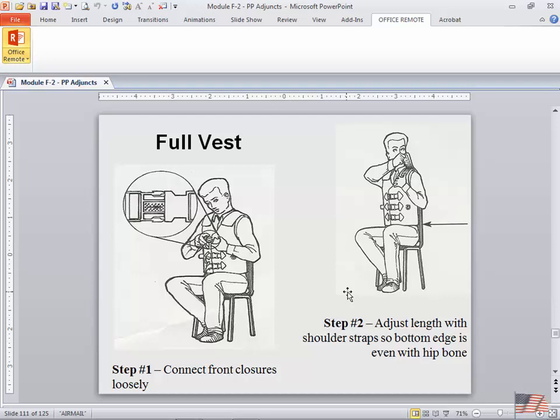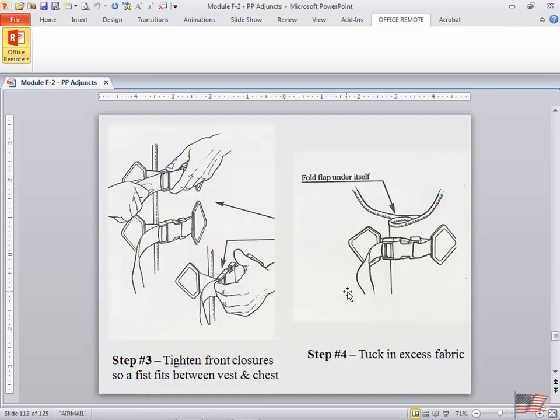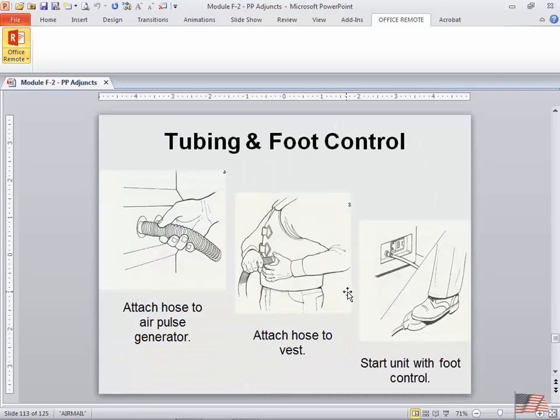So here you can see the patient sitting, and the nice part about this is the patients can apply it themselves. Where chest PT, someone else has to beat your chest. Here the cystic fibrosis patient can just sit and do therapy by themselves. Making adjustments. There's a foot control that then allows them to go ahead and turn it on, turn it off.